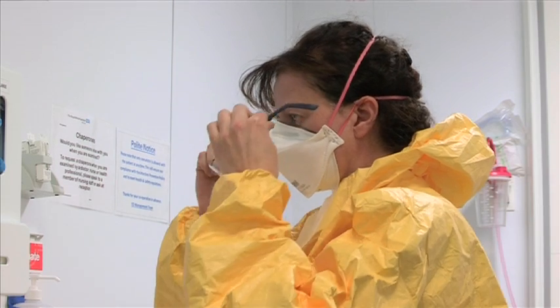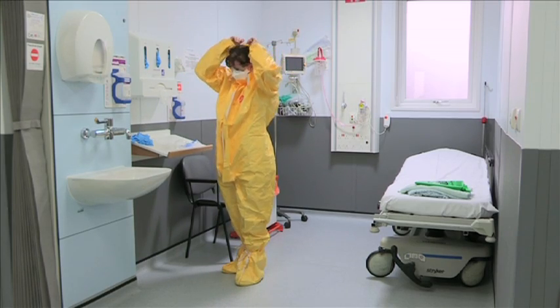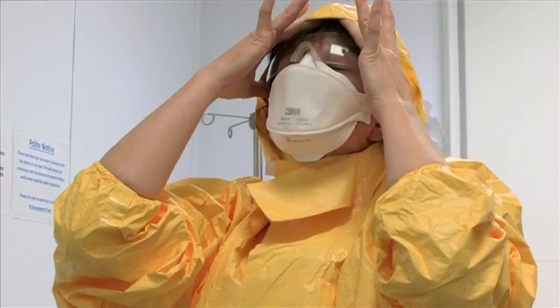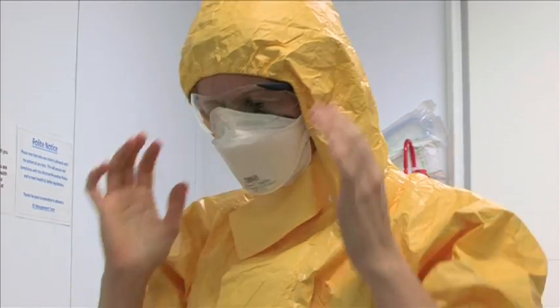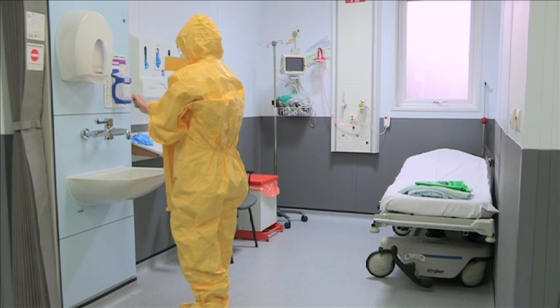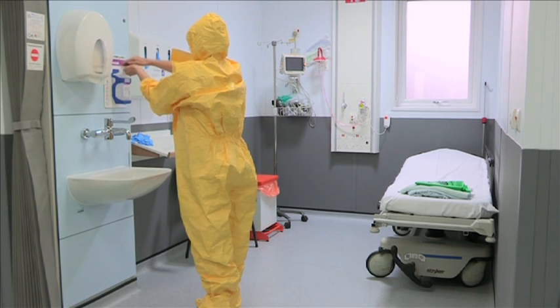Put on the goggles or face shield. Pull up the hood and ensure hair and as much of the face is covered. Decontaminate hands.